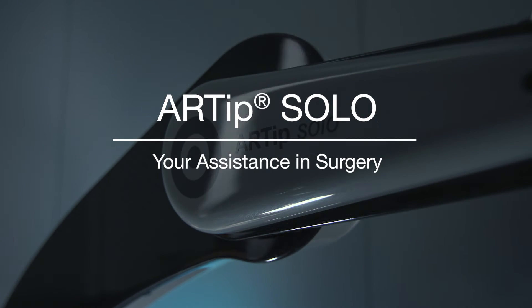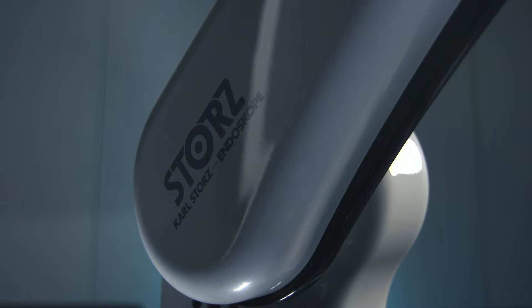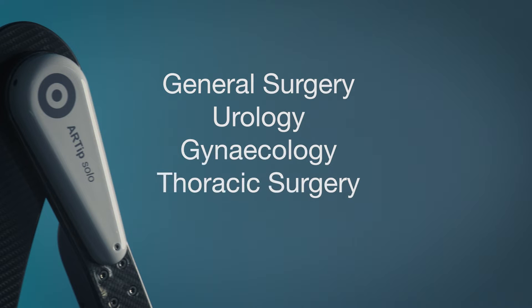Artip Solo is a robotic camera guidance system for 5mm and 10mm laparoscopes. It can be used in laparoscopic procedures in the field of general surgery, urology, gynecology, and thoracic surgery.